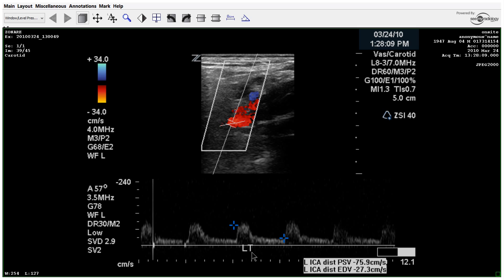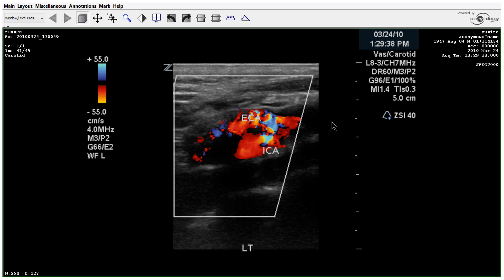The distal waveforms appear to normalize, although probably a little low. Even though the color fills right at the bifurcation, you can see there's aliasing right in this area. The velocity is up to 55 on the color scale, which is pretty high to still be getting this type of aliasing.